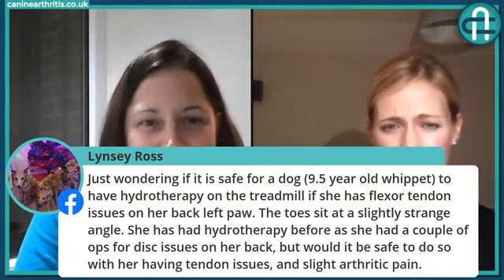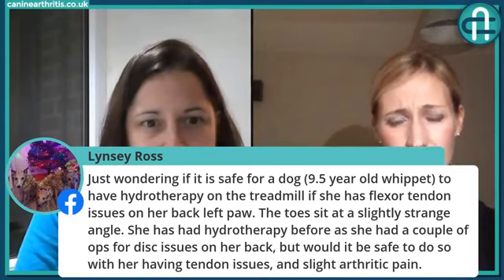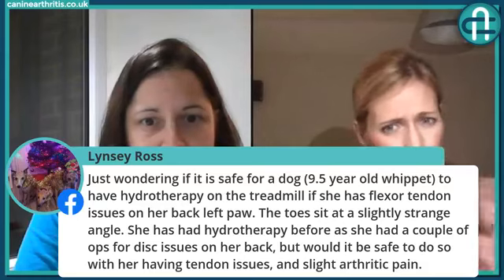Ooh, I probably want to know a bit more about the tendon issues and what the problems are. If it's a tendinopathy, which is any changes within the tendon itself, it should be fine. I would certainly see a physiotherapist first for an assessment and get their recommendation before undertaking that. With Whippets, I think they will be better placed in an underwater treadmill, because Whippets aren't natural swimmers, unless there are some special Whippets out there. The water displacement of the body relative to the limb length doesn't make them natural swimmers. So I think the underwater treadmill would be a safer form of hydrotherapy to perform.